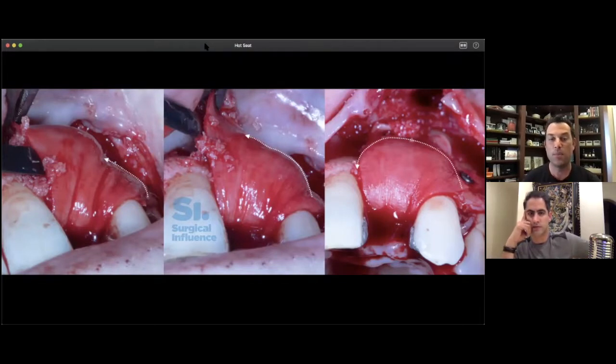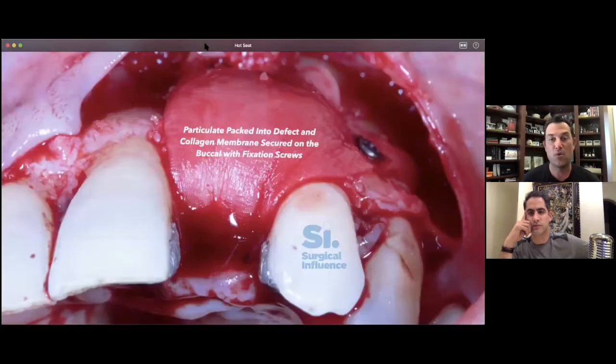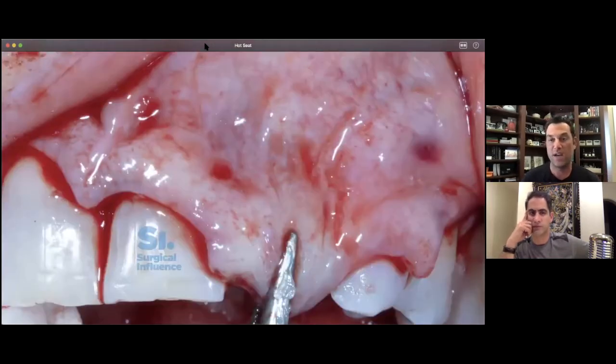I've learned that the hardest area to secure, I do first — in this case I'll tack or screw the membrane on the palatal first, which allows me to really overbuild the defect. Having adequate volume of bone under the membrane is the most important thing — we often don't use enough bone. If we don't maintain the space and stability of the graft-membrane complex, we won't achieve the results we want. Dr. Israel Putterman, my partner in our bone grafting course, has made me much better at placing bone graft where we need it.